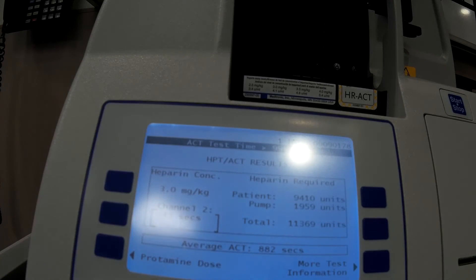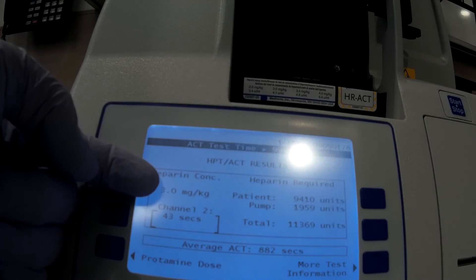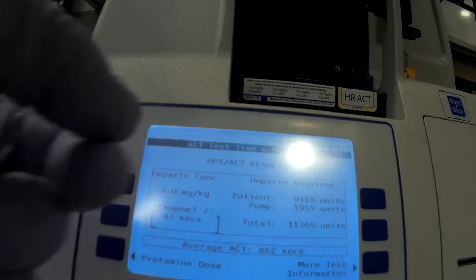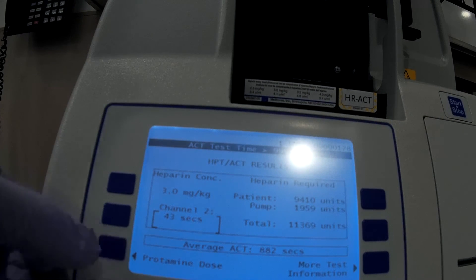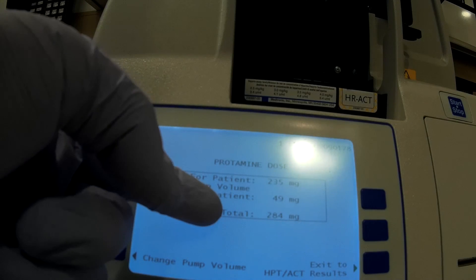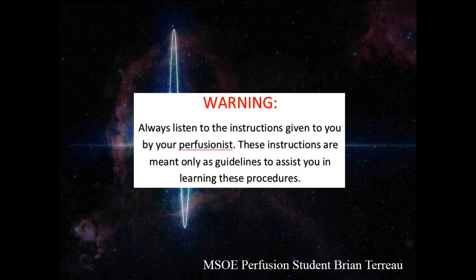When the machine is finished, you will see the heparin concentration — here it is listed at 3 milligrams per kilogram — and the total amount of heparin required for the patient, in this case almost 12,000 units. You can also check the necessary protamine dose to reverse the heparin on board; here it is 284 milligrams, or 7 milligrams per kilogram.